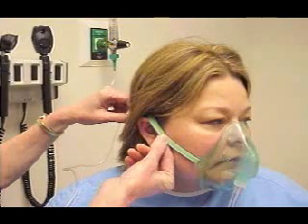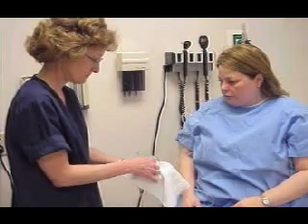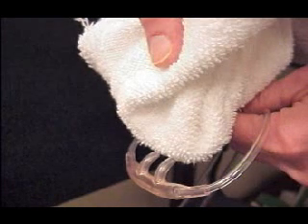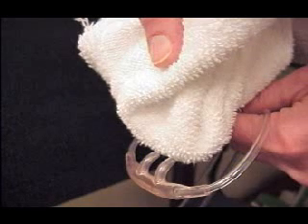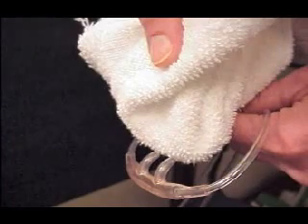The patient who has oxygen has special needs. Make sure that the elastic band does not create pressure on the ears or head. Adjust the face mask so that it fits snugly to help the patient receive the amount of oxygen ordered. Wipe collected moisture out of the face mask with a damp cloth each shift. Check the nasal cannula to make sure that they are clean and not irritating to the nostrils, and wipe the prongs with a damp cloth. Pad the top of the ears to prevent any irritation from the tubing.